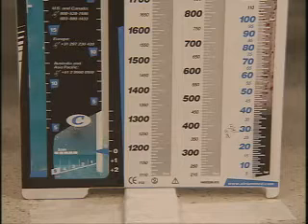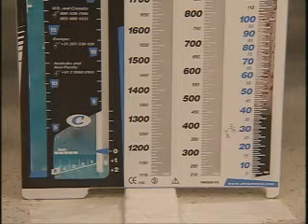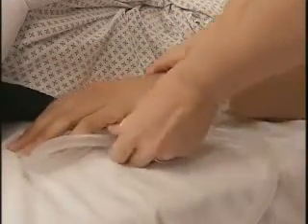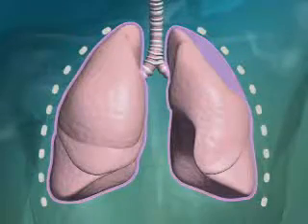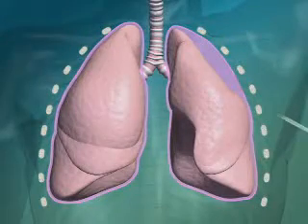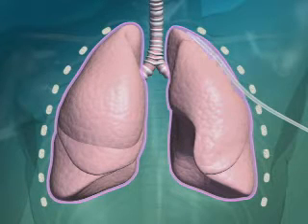The absence of tidaling commonly indicates an obstruction, which can occur when the tubing is kinked, compressed, or clogged, or has a dependent loop. Absence of tidaling can also occur when the lung is reinflated because the negative pressure in the pleural space is restored.